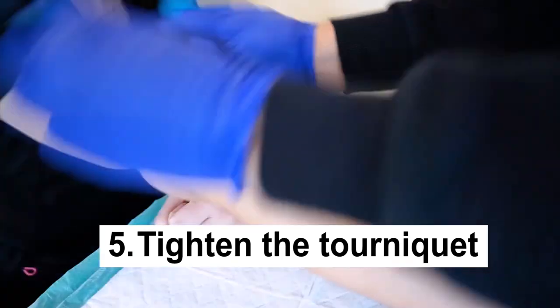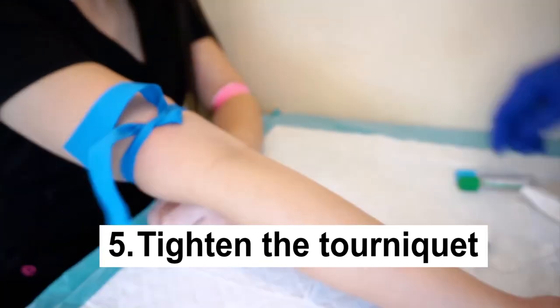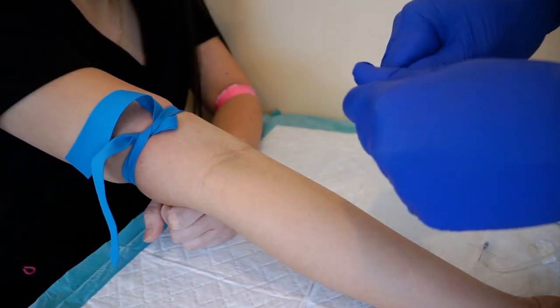Fifth, tighten the tourniquet 3 to 4 inches above the drawing site, making sure that the tail of the tourniquet is away from the site.